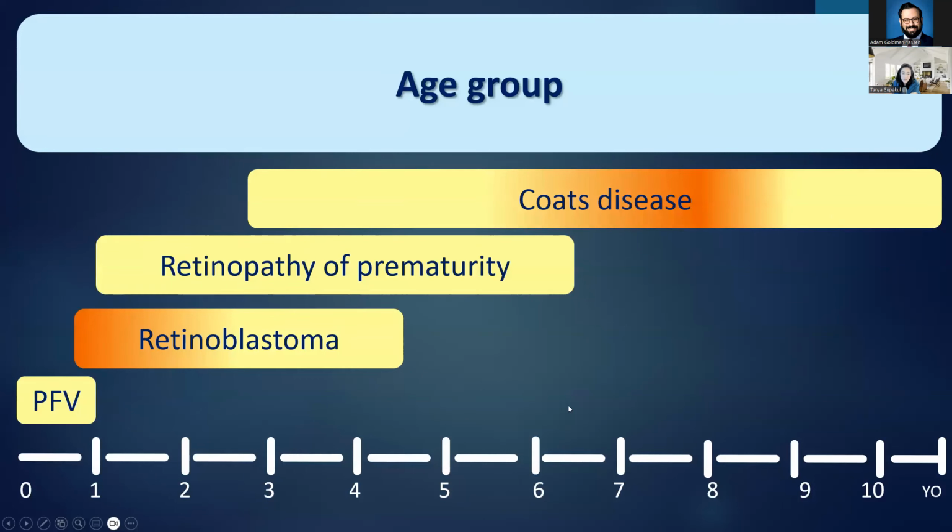So I think for leukocoria, T2 3D is a must. But sometimes, because we normally do these patients under general anesthesia and we normally do a scan check, when we see those things, and if the DWI of the brain can give you better resolution for the tumor grading, we don't do the small field of view. But if the lesion is too small, we normally do a thinner cut on the DWI, like a small field of view, like 2 millimeter thickness at least, to improve the resolution of the images. Yeah, I think that's definitely what we do.